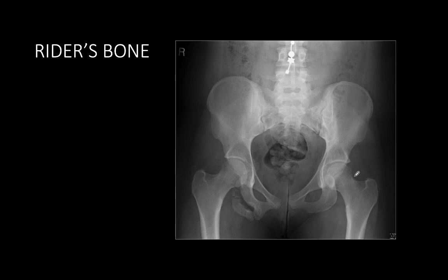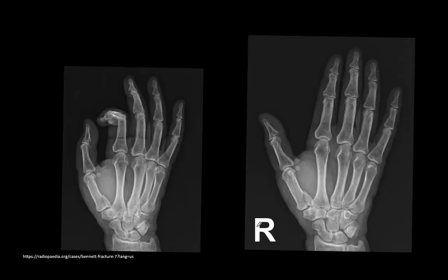These are often seen in people who have a lot of hamstring action, so historically named after horseback riders, hence rider's bone, but can be seen in things like cheerleading, hurdling, a number of activities where the hamstrings are heavily engaged, and this hypertrophic change to the avulsed piece is what we end up seeing. So they call these rider's bones. Ischiotuberosity location, really apophysitis and avulsion that ended up hypertrophying.